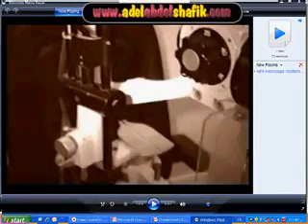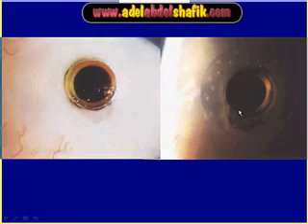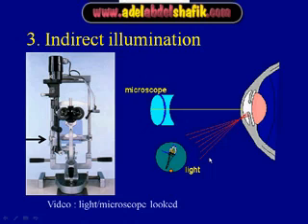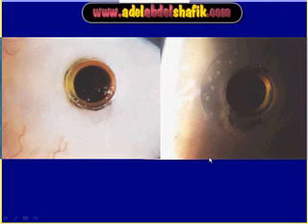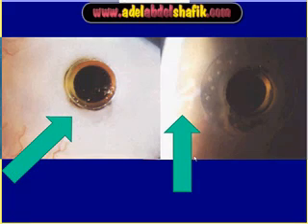By dealing with this knob, you can make the microscope focus in one location and then change the light to the side of the point of focus. This is known as indirect illumination.